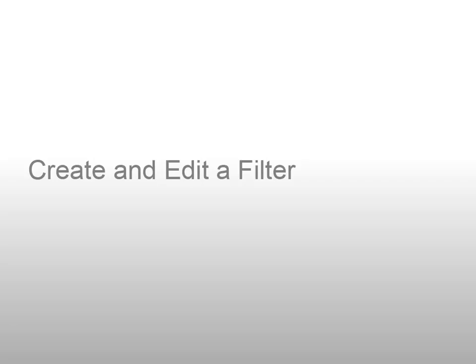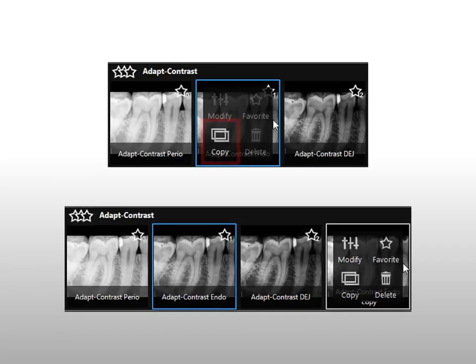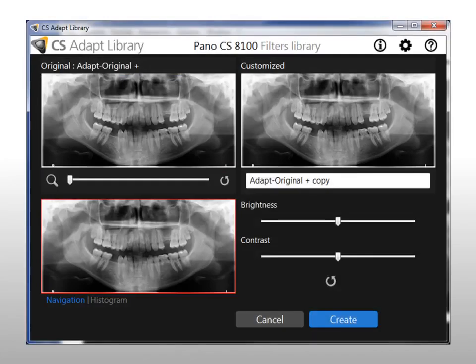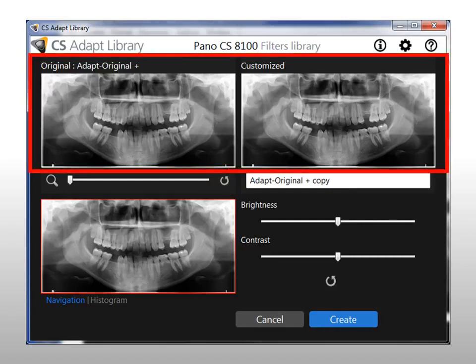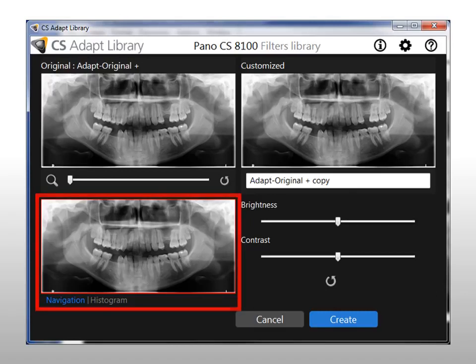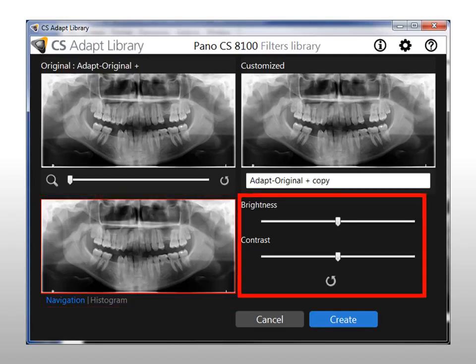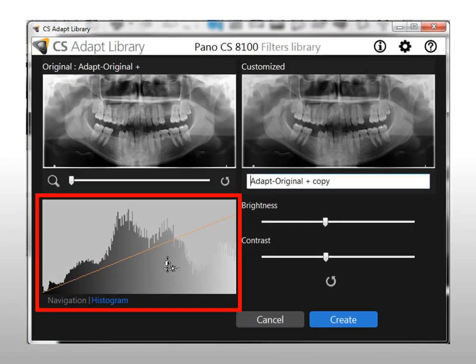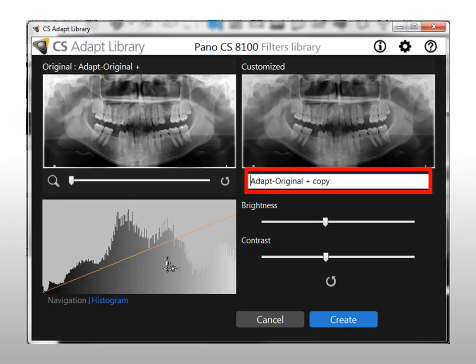Create and edit a filter. To create a filter, first copy an existing filter. Click here to copy an existing filter, then select the filter copy and click Modify to create a custom filter. In the Customize window, you can name the custom filter, view the original filter and the customized filter, zoom into an area of the image, and adjust the brightness and contrast sliders or adjust brightness and contrast with the histogram. When adjustments have been made, name the custom filter and select Create to save.